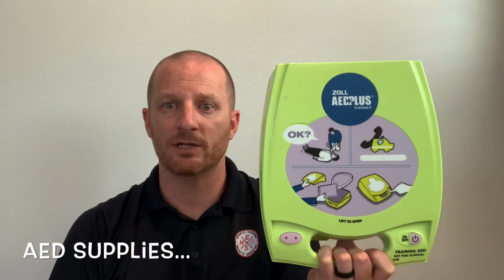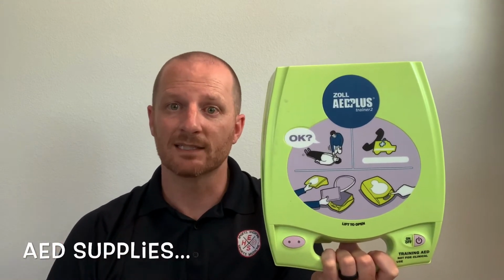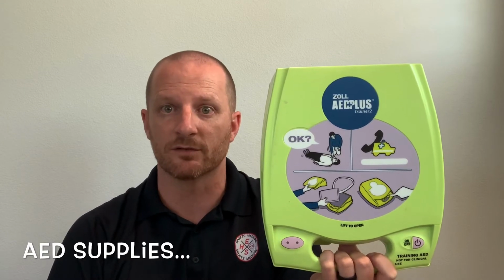If we get to a patient that is under cardiac arrest and we don't have an AED available, we want to send somebody for an AED, and when they get back with the AED, we want to immediately put it on the patient because this doubles the chance of survival.